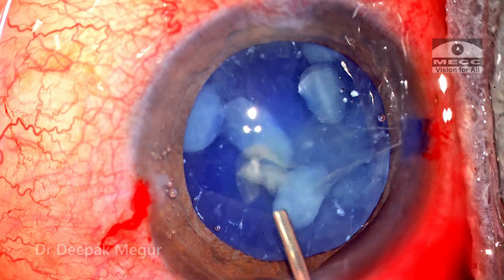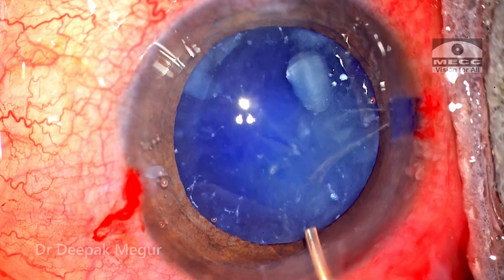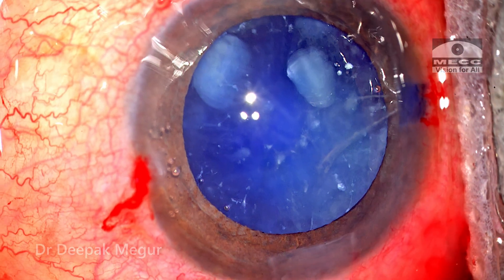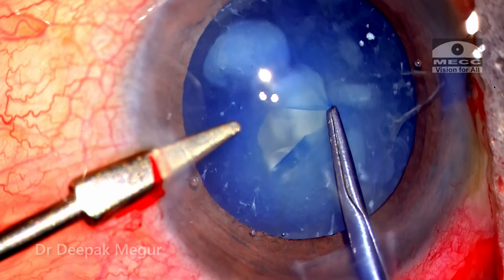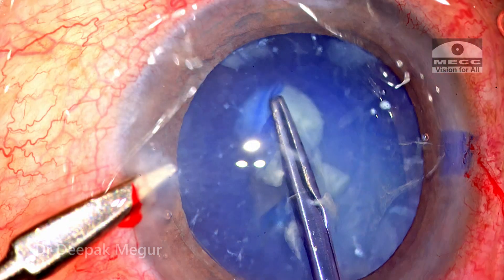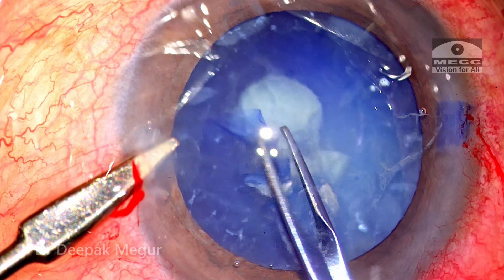As I'm irrigating out, I realize there is no nucleus — there's a small tiny fragment, probably the endonucleus, which is just expressed out of the bag. So the entire cataract is almost absorbed and only liquefied cortex remains — that was the impression I got. I go back with my forceps, trying to grasp the flap. Visibility is extremely poor but eventually I get hold of the flap and try to create a rhexis.